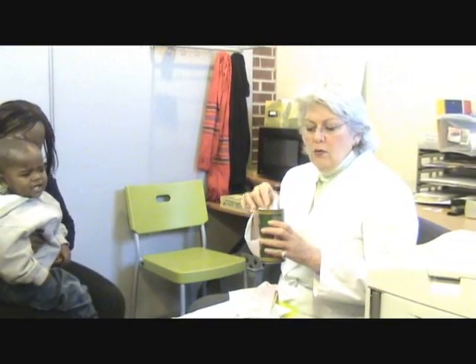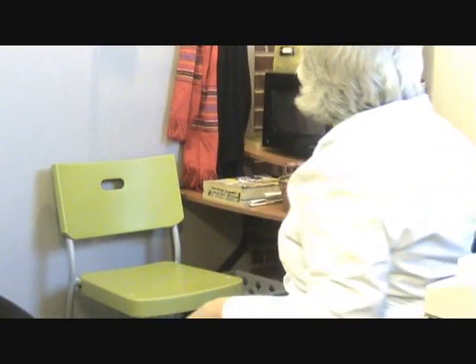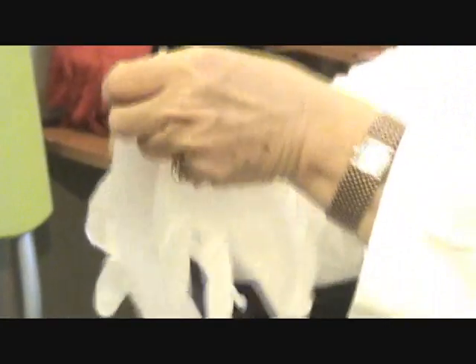Before I collect the mouth swab samples, I'm going to either wash my hands or use a handy wipe, which I have right here. I'll wash my hands with the handy wipe. Now for sample collection, I wear clean gloves — they're powder-free, latex-free gloves.